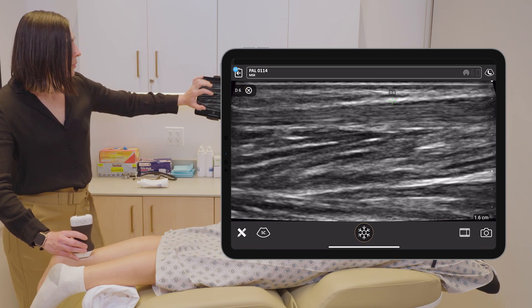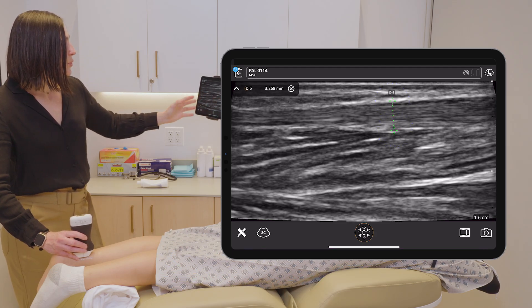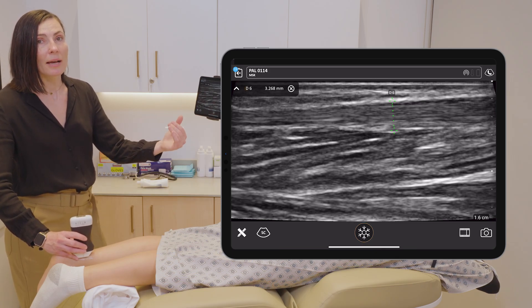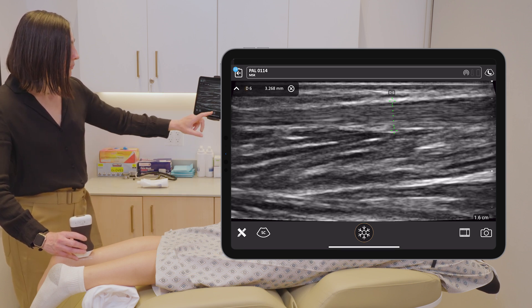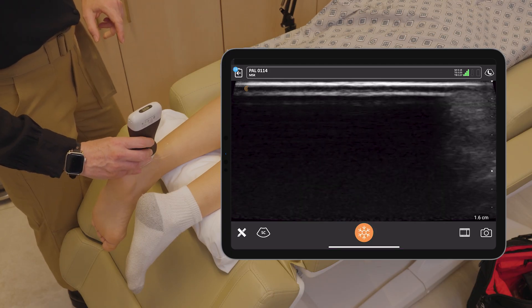After freezing the image, I drop my calipers to get a measurement. Here we are getting about 3.2 millimeters. You can actually compare it to the other side, so if you have an affected and an unaffected side, you can have an actual comparison appropriate for the patient. In this case, this is normal.